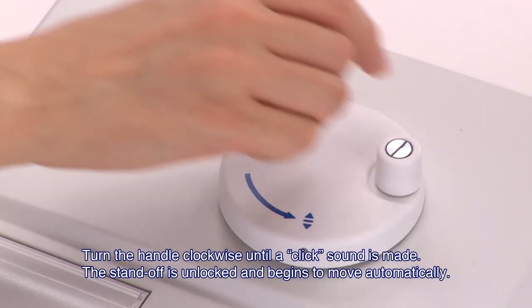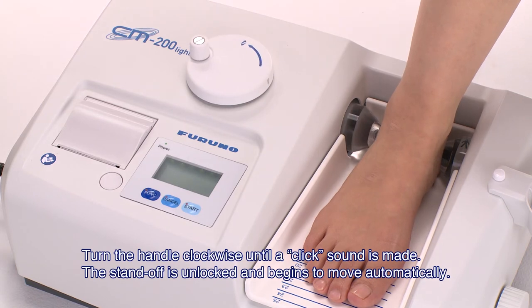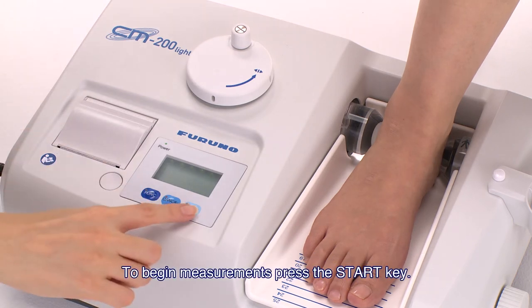Turn the handle clockwise until a click sound is made. The standoff is unlocked and begins to move automatically. While the standoff is moving, release the handle and wait until the standoff holds the patient's heel tightly. To begin the measurement, press the start key.